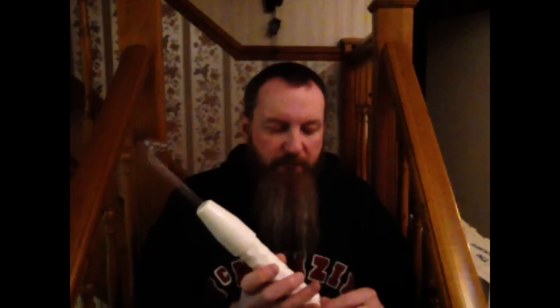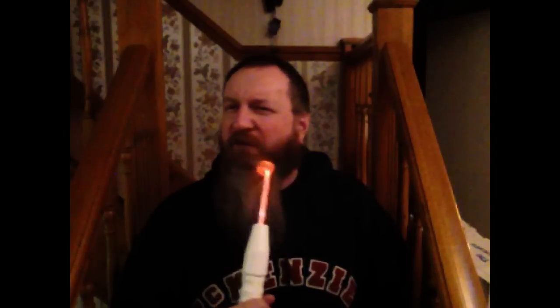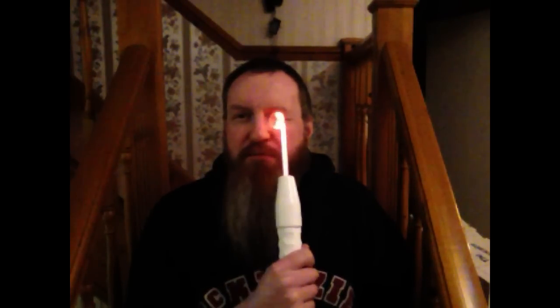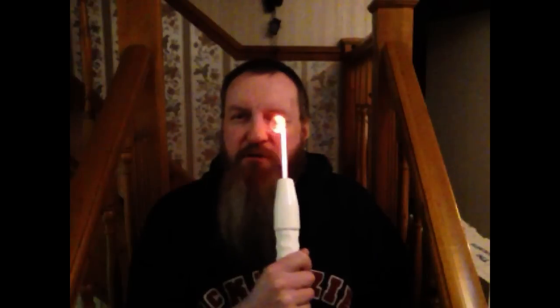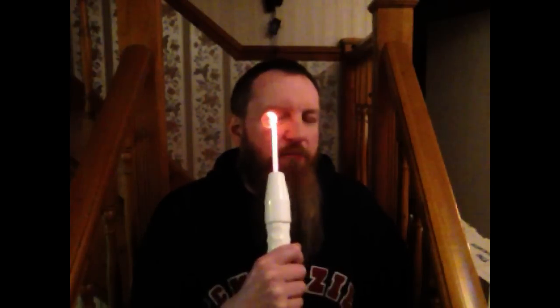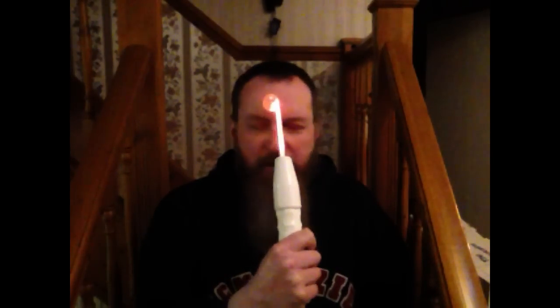And they generate high voltage at high frequency. The idea was that you applied it to parts of your body, like the skin, or the beard, oh that's quite tingly actually, and you could apply it to your eyes, because that sounds like a really good idea, applying high voltage to your eyes. Oh, feel the healing energy. I'll probably be blind tomorrow, I'm not really sure about that.